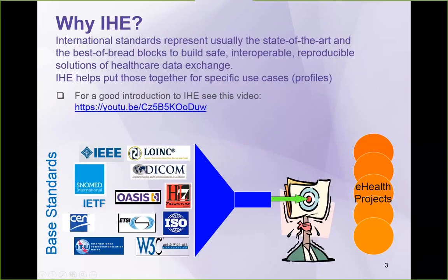So first, just a brief introduction: what is IHE? We're basically taking all the different standards that are out there, like HL7, that describe how to put things together for different use cases, and LOINC and SNOMED and DICOM. And we're looking at specific use cases that we want to cover and putting those together into integration profiles. And that's what IHE is about. If you need more background on what IHE actually is doing, there's a really good YouTube video, and we have a link to that YouTube video in the slide set. And I'm assuming the slide set's going to be available afterwards for you guys. Next slide.